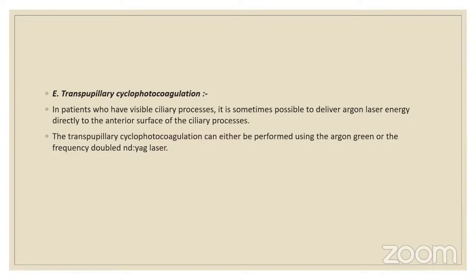Transpupillary cyclophotocoagulation: in patients who have a visible ciliary process, it is sometimes possible to deliver argon laser energy directly to the anterior surface of the ciliary process. Transpupillary cyclophotocoagulation can be performed using either the argon green or the frequency-doubled ND laser.